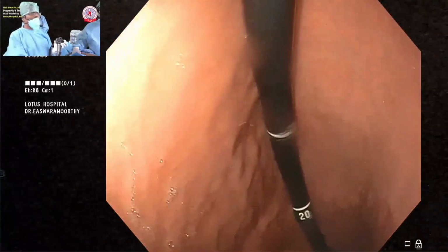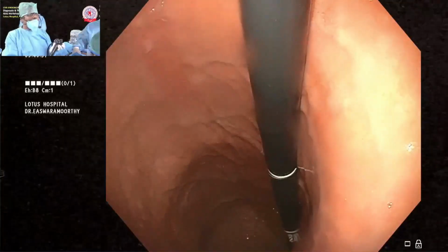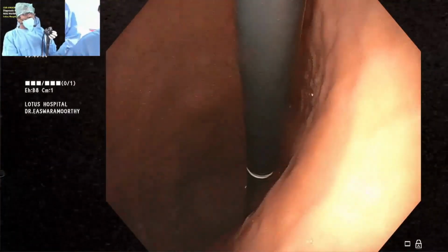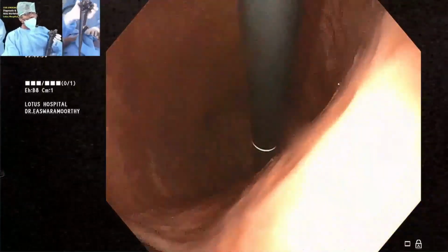and do a big wheel towards you, do a J maneuver anti-clockwise. The thing you should not do is turn this way. Say, this is an awkward movement. You have a wrist strain. You don't do that. You do this movement. It is good for your morning dance and also body movement. So this is a movement we advocate.